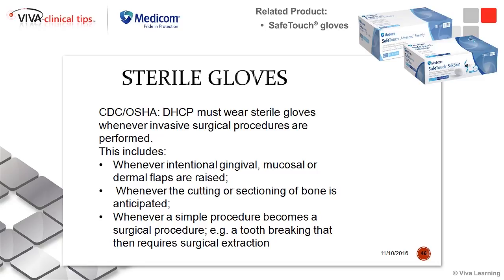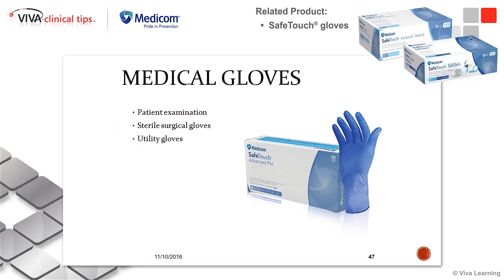We all know what we need to be doing with sterile gloves. That's one of the things that I wonder about what happened in those communities where we've got an increase of infections with pulpotomies. Were they wearing sterile surgical gloves? Remember that medical gloves, both patient exam and sterile gloves, are to protect your hands when you touch mucous membrane, blood, and other body fluids, or items contaminated with these materials. Wearing gloves also reduces the likelihood of transmitting organisms from your hands to the patients during dental procedures.